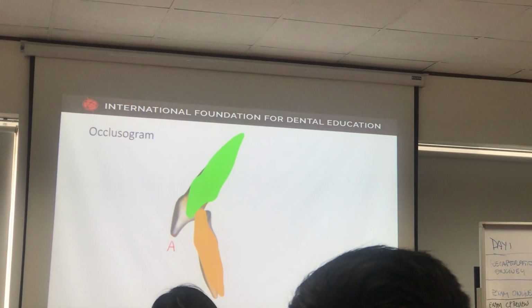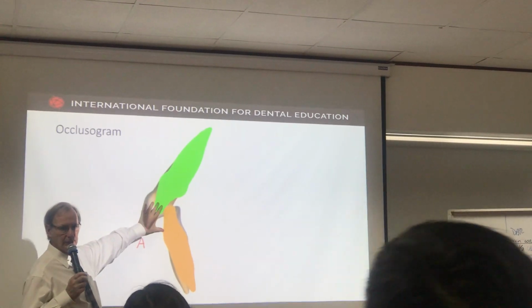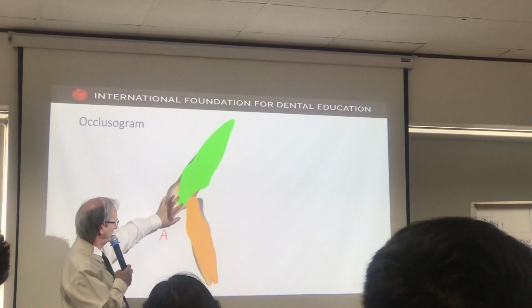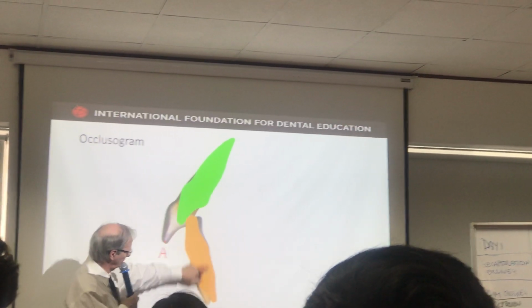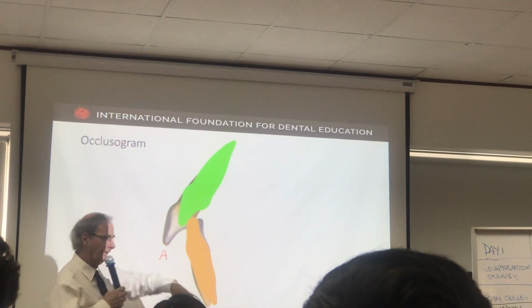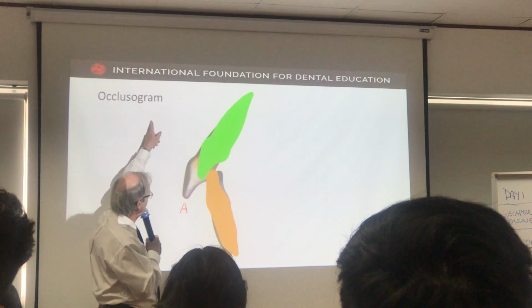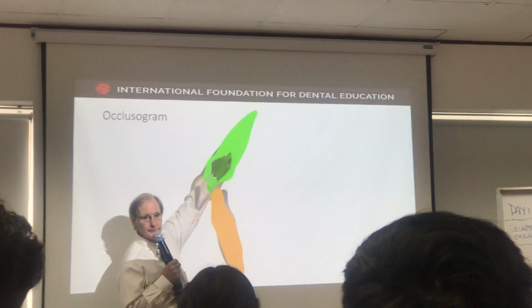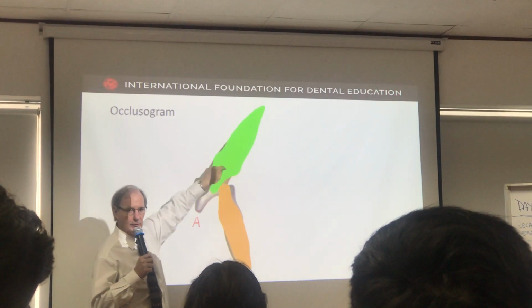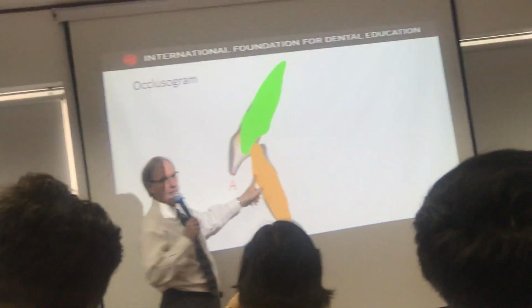So the deal is that you have a case like this that should be in your head. These are deep bite, overjet, this is what I want. This is my occlusal plane. So maybe I can afford to blast the incisor forward a little bit. That's not so bad, and it's part of the orthodontic thing. But this tooth is not going there, certainly not, it's going there. So the mechanics has to mimic that. Okay? If you just put a straight, strong, round wire and you push, the tooth is going there.